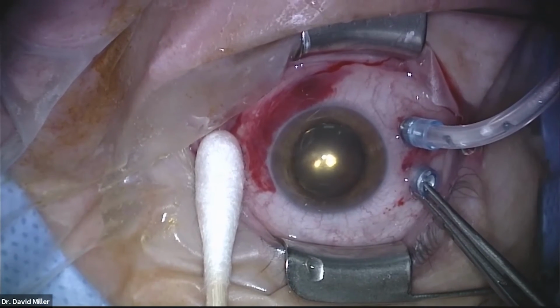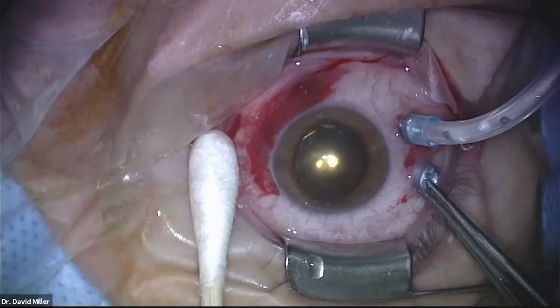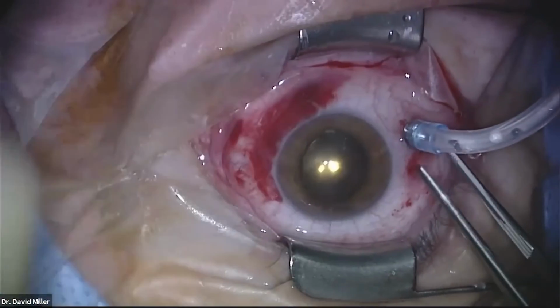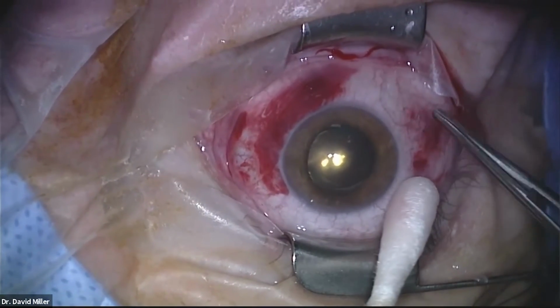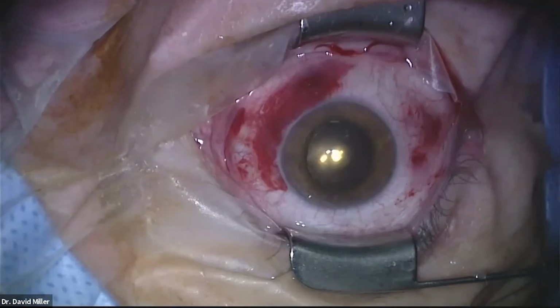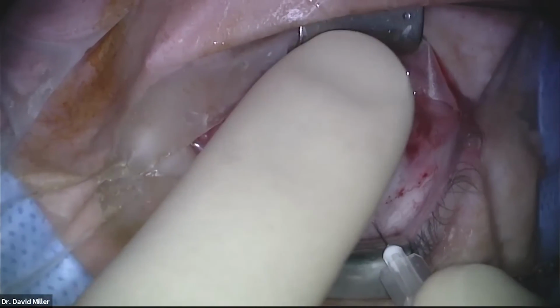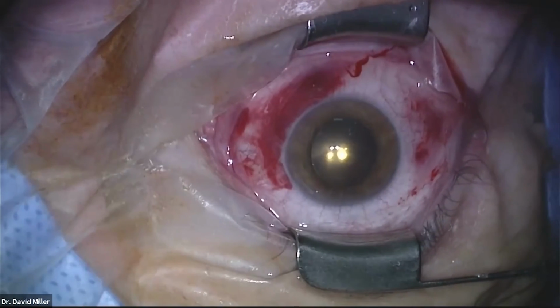Now we're flipping in the C3F8 gas. I'll hold a Q-tip here. Okay, down to 15. Okay, go ahead. Very good. We need some gas again, just like the last case. And there's our sclerotomy sites. Everything seems to be swelling shut very nicely. We're going to inflate the eye a little bit, again, to keep a nice firm eye and gas filled. Keep going there. That's good. So that's kind of the case.